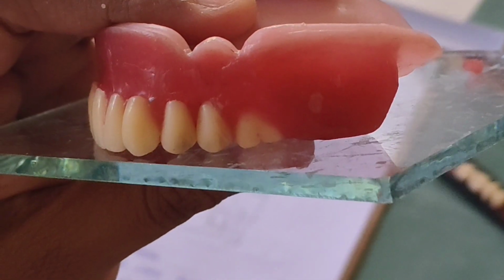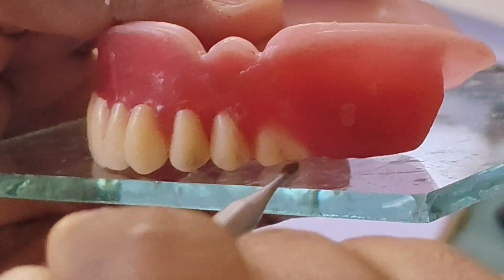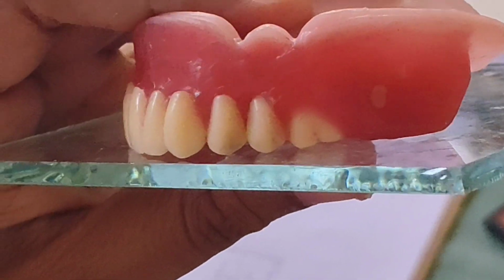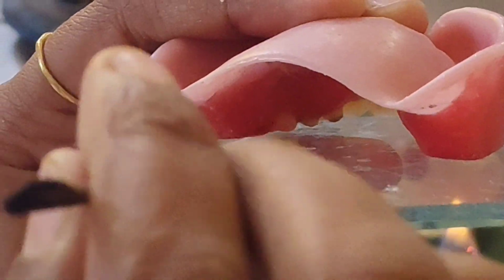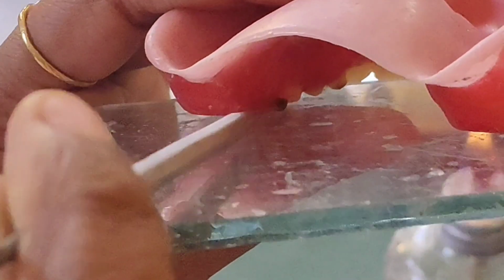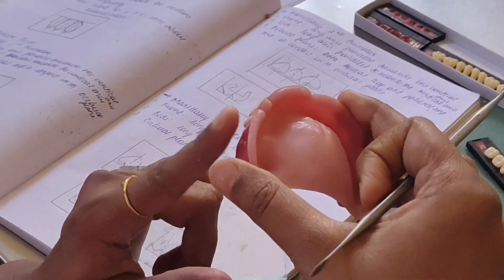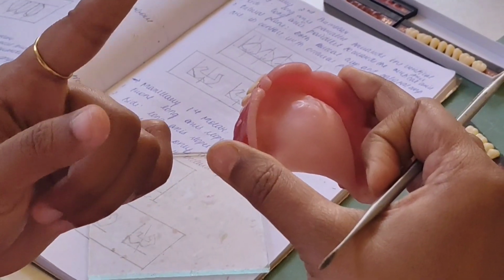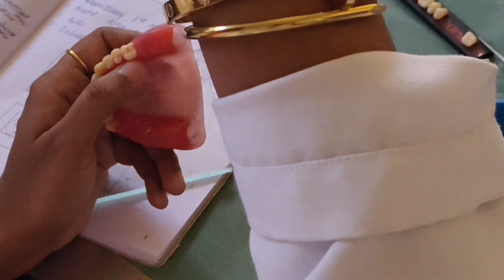Buccal cusps are a little above. In that also, the mesiopalatal cusp is touching the glass plate. If we see from behind, I'll show you again later also. See from behind, this mesiopalatal cusp is touching the glass plate, this cusp. Molars again straight, but this first molar towards the mesial side will be tilted like this. First molar relation only is very important. Towards mesial it will be tilted.